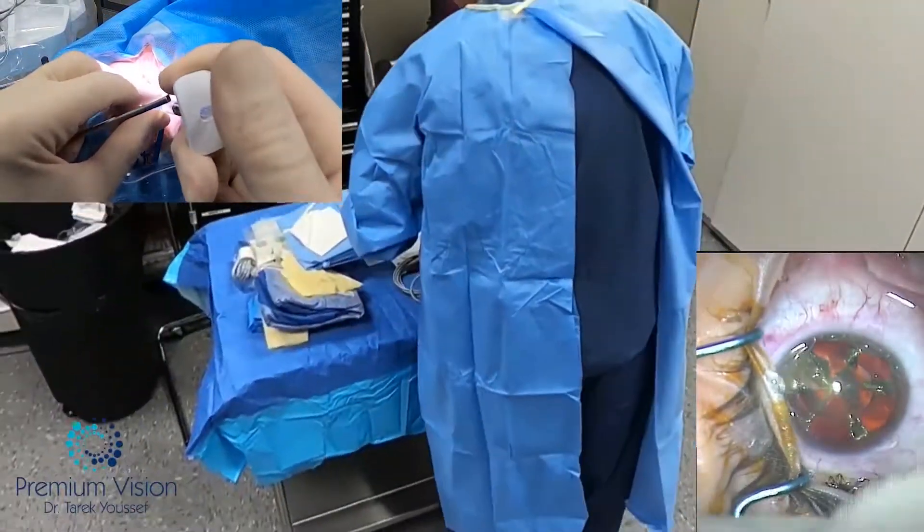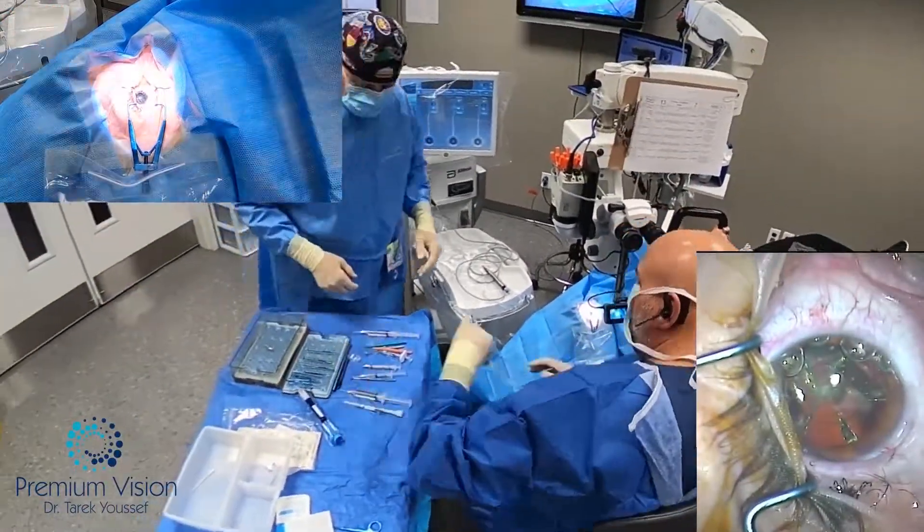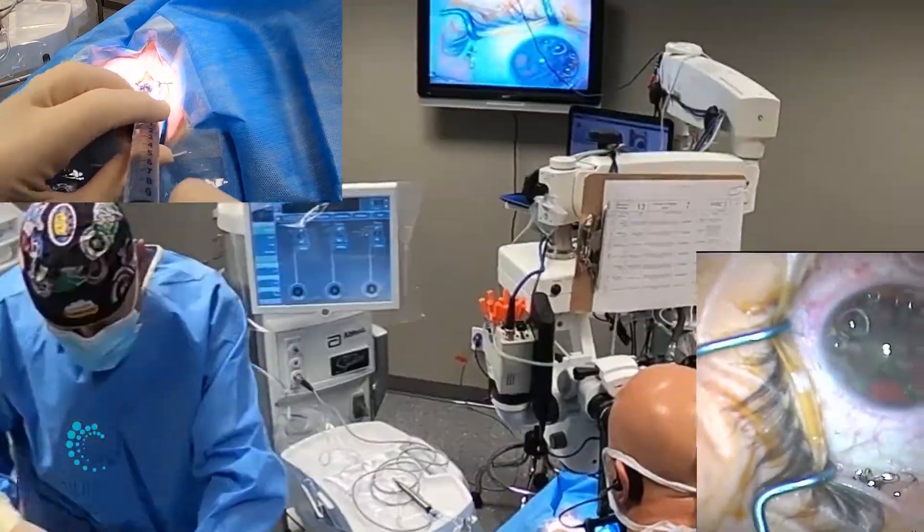Started by applying the viscoelastic injection, the endocoat, covering the cornea — the front and the back. Here I have to make sure that the cornea is completely covered in the back because of the Fuchs dystrophy.